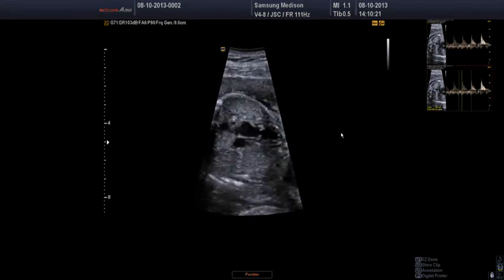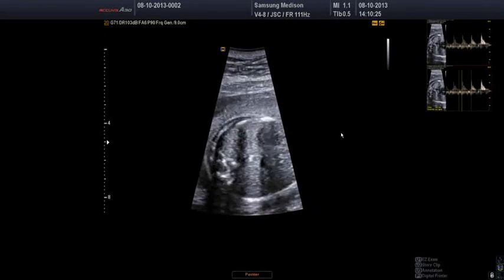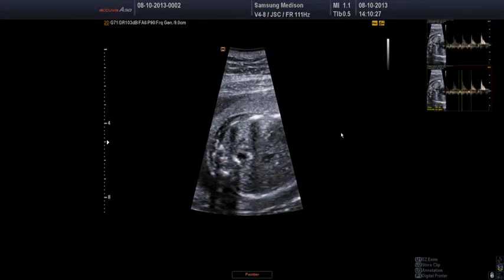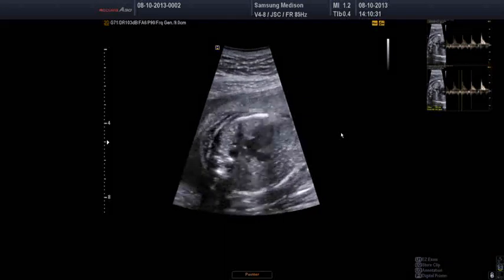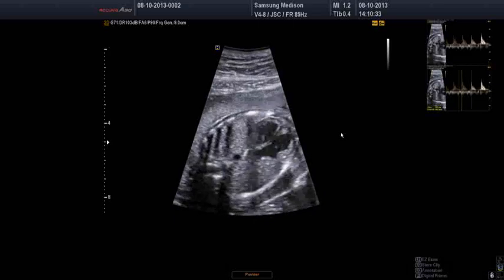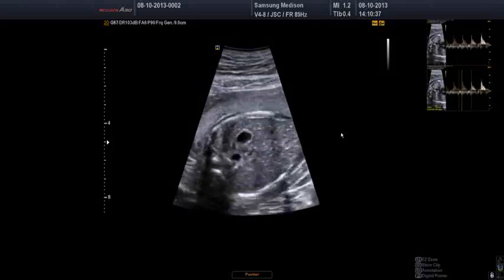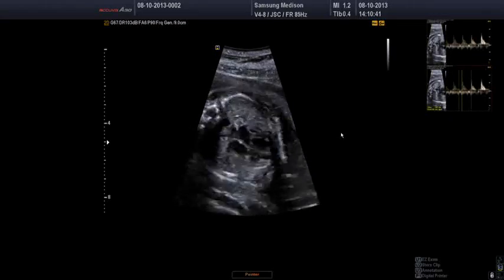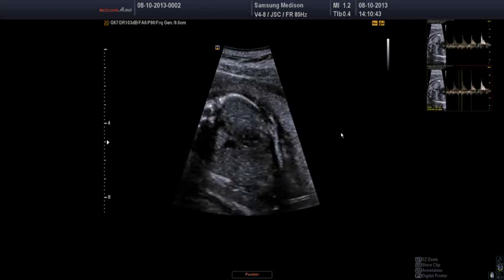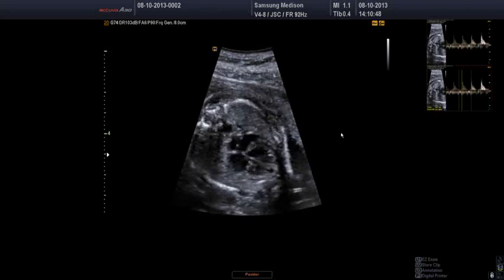So the other point I want to make, if I still have time, is that we started over here, which is where there was a good window to see kind of an apical four-chamber view. You see that I ended up moving the maternal abdomen lower down, which was much down here. So quite often, don't be put off by having the fetus in this position.